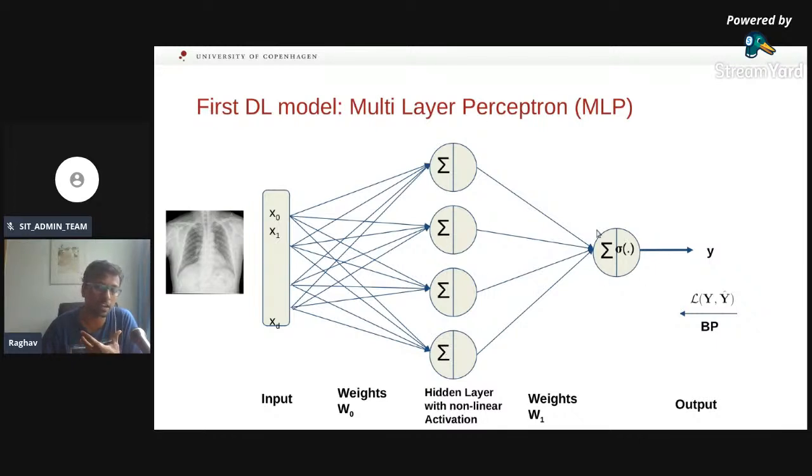And then you have the output neuron here where you do this computation again. If you don't have the hidden layer, it's the same as the linear classifier we had from before. If you have introduced a hidden layer, then this is a deep neural network already because it has a depth of 1. Once you have this network, we do the learning from data.